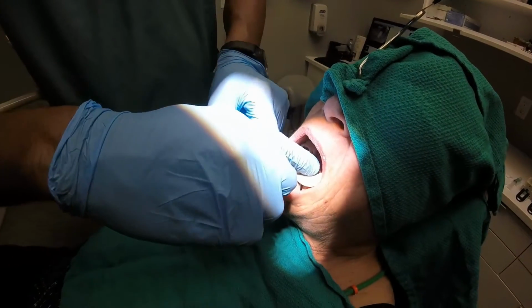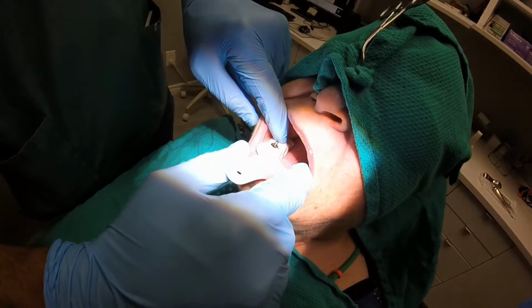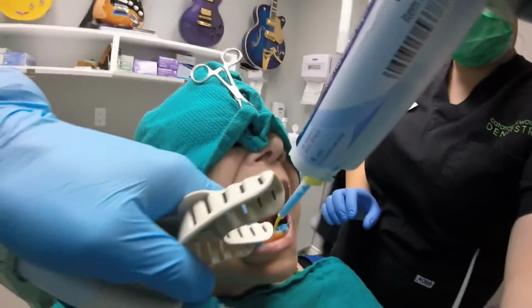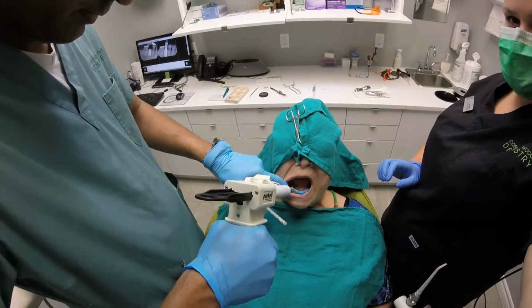This is very important because, as compared to the closed tray impression techniques, when you don't actually have that screw port open, you're going to have a hard time getting that impression tray out. You can actually pop it off the impression coping, but this can lead to lab errors.